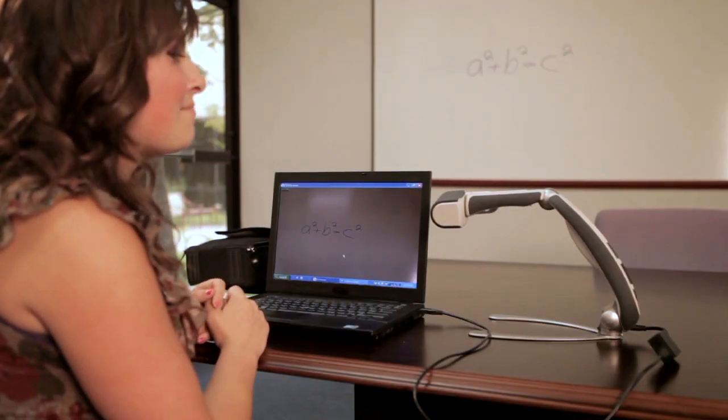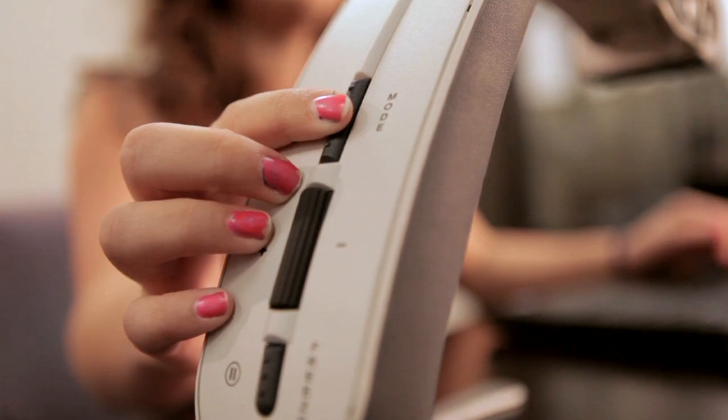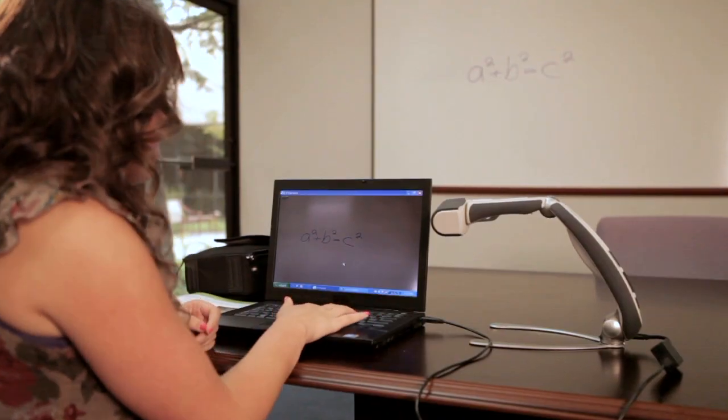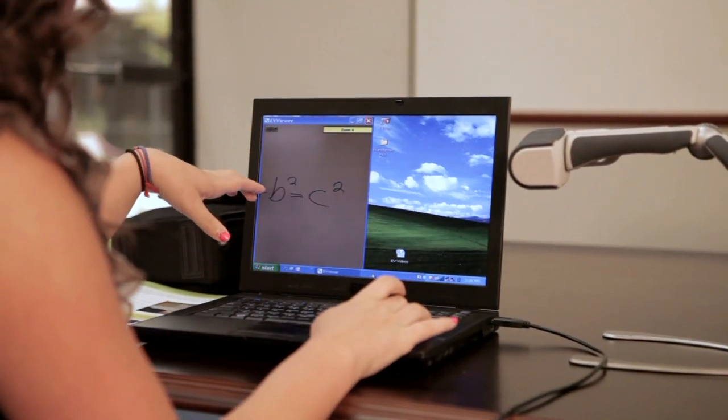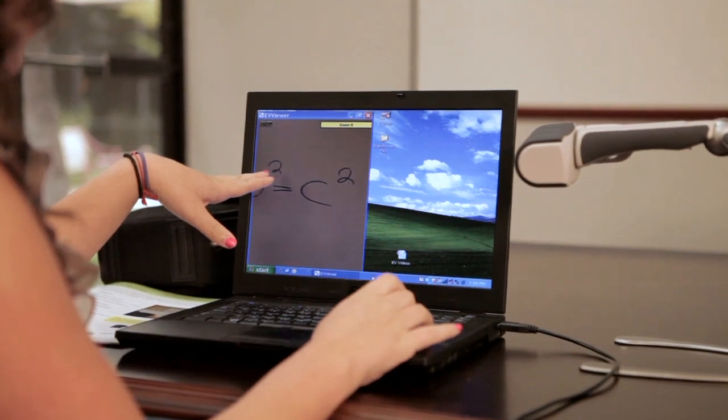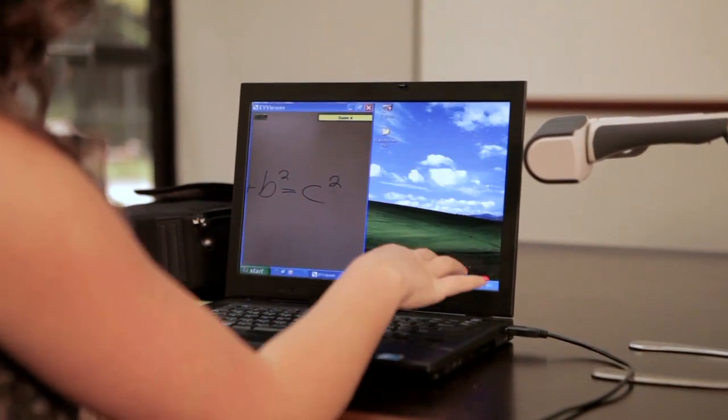Also, you can change the mode either along the side of the Transformer or by pressing M, depending on what contrast works better for you. So by pressing F8, it splits the screen. So if you wanted to be using the Transformer while on a word processor or while looking something up on the internet, it makes it totally accessible.